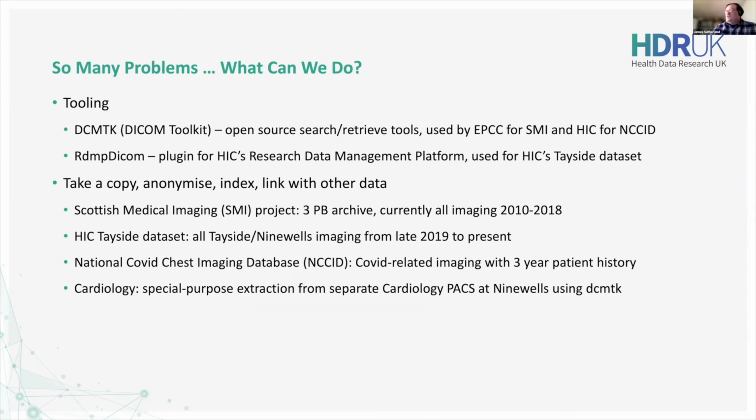They ended up, the Royal Surrey Foundation Trust set up a server for all the other hospitals in England to send their data to. And they went around getting relationships and technical connections to every PACS they could get to in England, and that's ongoing as they go around talking nicely and twisting arms of different hospitals across the whole of England, one by one, to get them starting to send data through. They do that, in fact, through a separate system from Siemens called the Image Exchange Portal, which is a service for transferring data between PACSs.